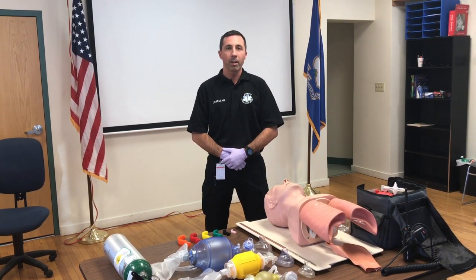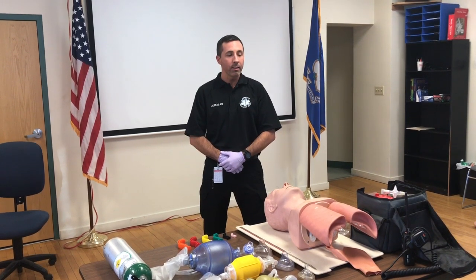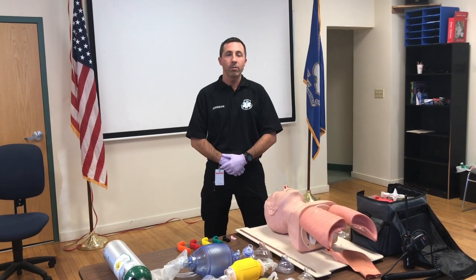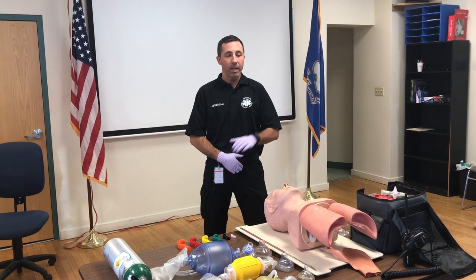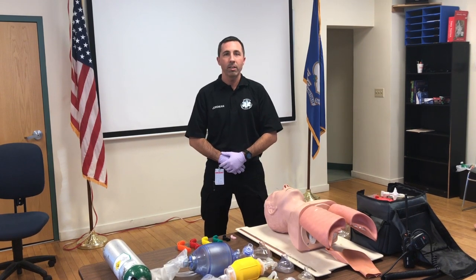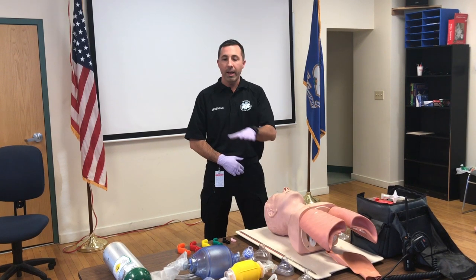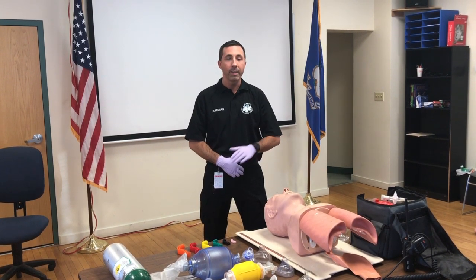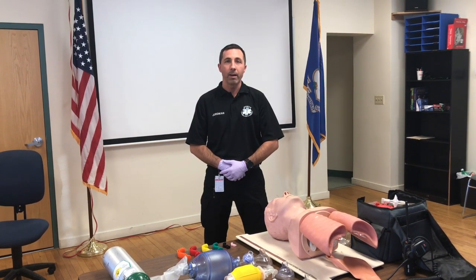So before we start, there's a couple of things I want to cover. One, it's a 5-minute station. Secondly, when you're performing this station, you need to remember that you have to ventilate your patient for one full minute. The first time you ventilate, it's going to be unattached to oxygen. Make sure you do it for a full minute. The second time you ventilate, you're going to make sure that your O2 tubing is connected. And again, you're going to do it for a minute. With that, in the station, make sure you're wearing a watch. You need to keep track of time.